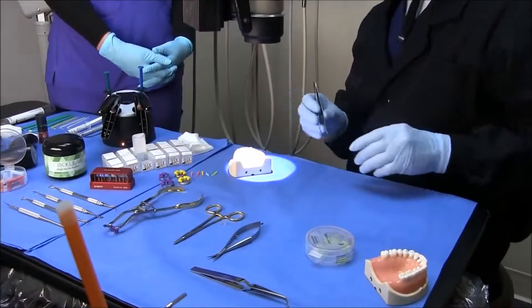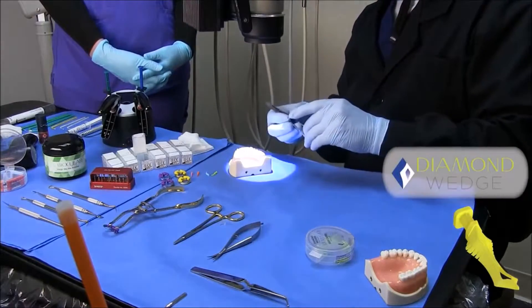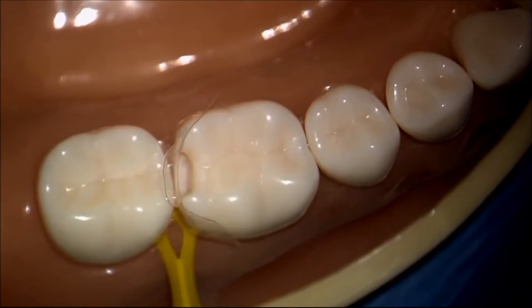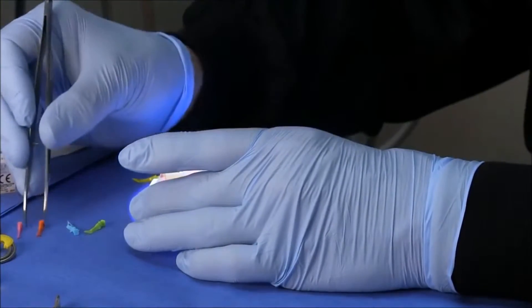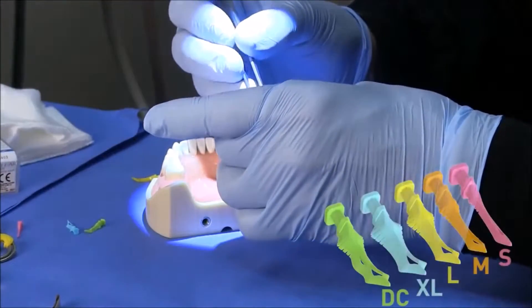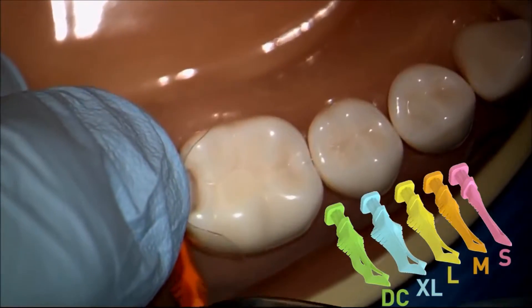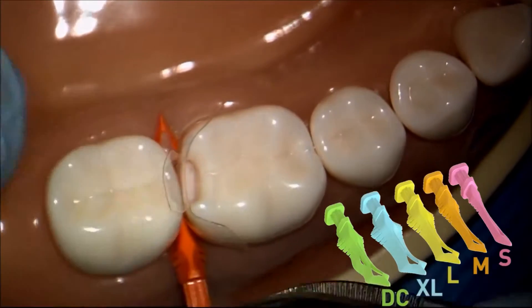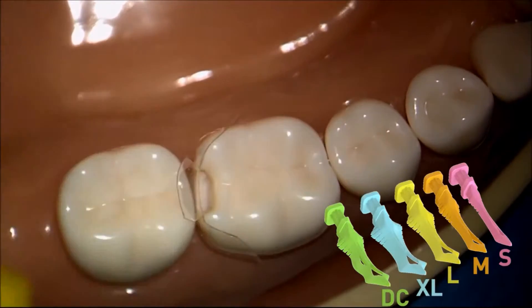My favorite wedge for most restorations is the large wedge. It looks a little bit too large for most areas, but because it collapses as you insert it, this is my go-to wedge. I'll start with the medium wedge — you can see it slides in a little too easily. I'm going to hold the matrix down so it doesn't slide. This isn't doing a lot of work, so let's move to the large wedge.